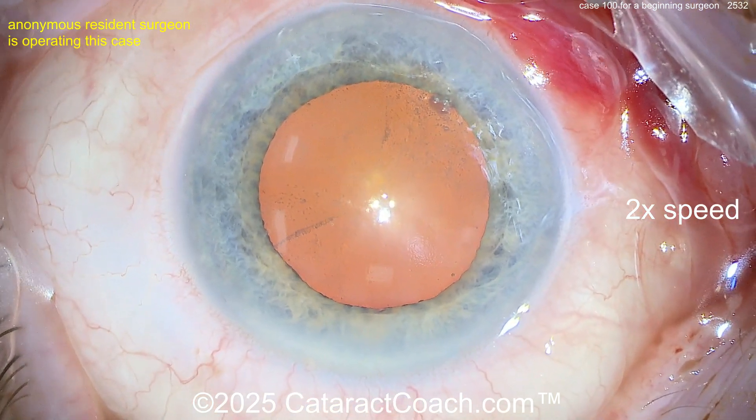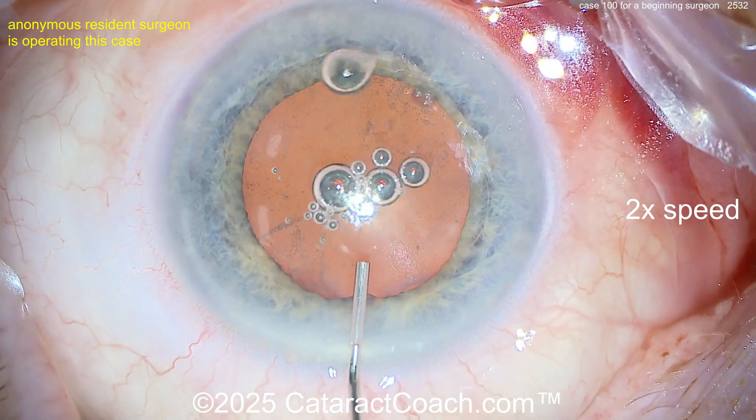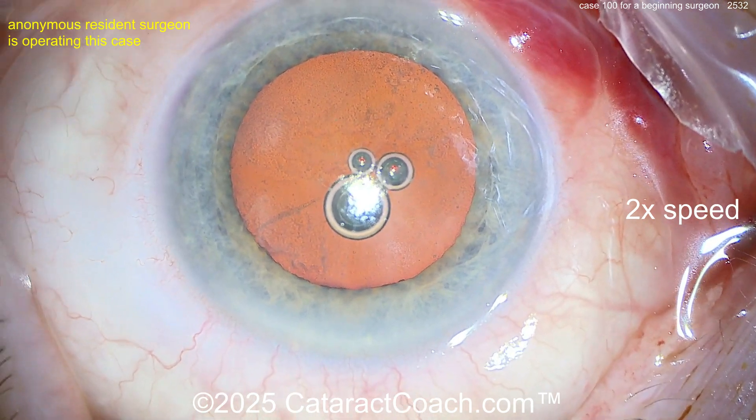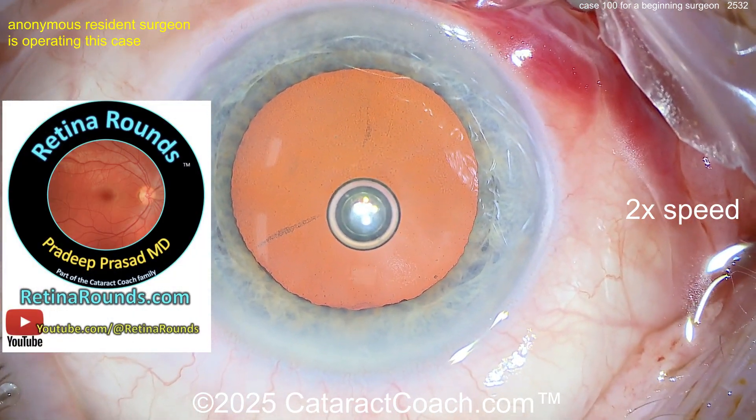The main incision is starting off a little too much in clear cornea for me — I wish he'd hit the limbal vessels a little bit there. Now putting in probably some anesthetic inside the eye. The draping is not so hot — look at all the oily stuff in the tear film all across the eye, again not ideal.